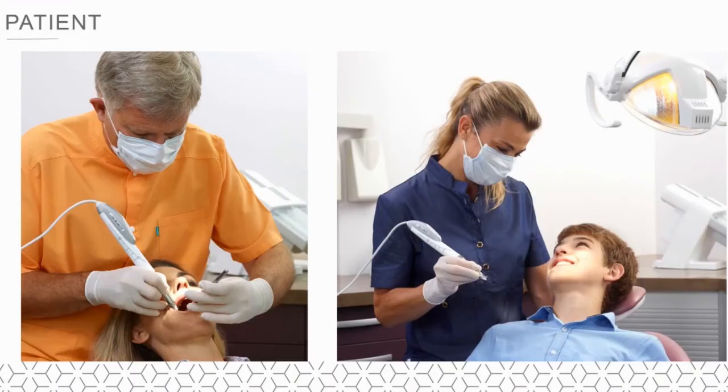Intraosseous anesthesia can be used on adults and children. Children are smaller, therefore we use a smaller 9mm 30 gauge needle, and we use a reduced volume of anesthetic. An important difference between the protocol for adults and children is that up until the age of approximately 10 or 12 years old, you will hardly ever need to perform a rotation in order to access the cancellous bone. Manual pressure is sufficient.